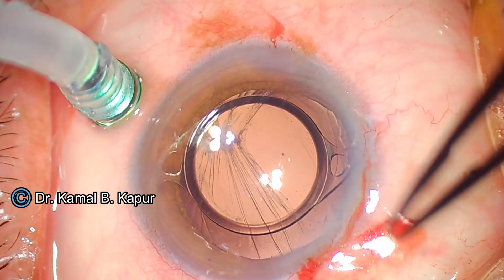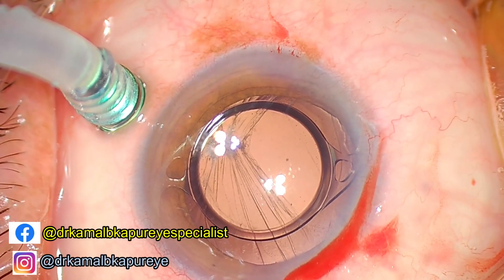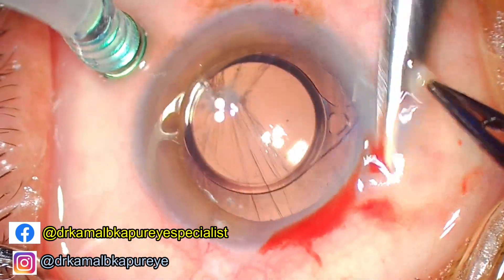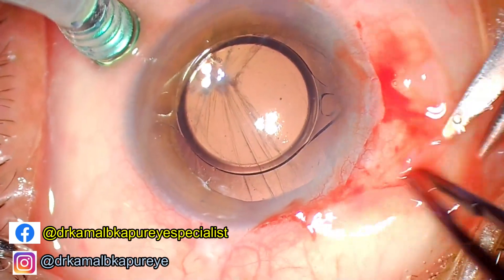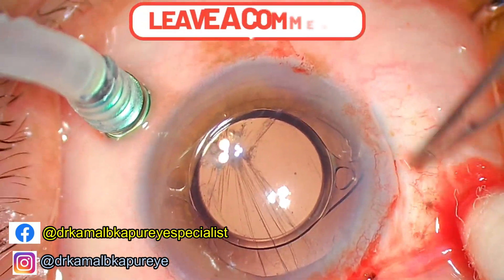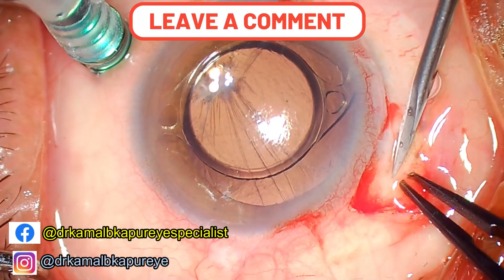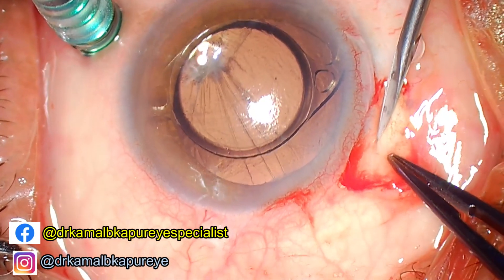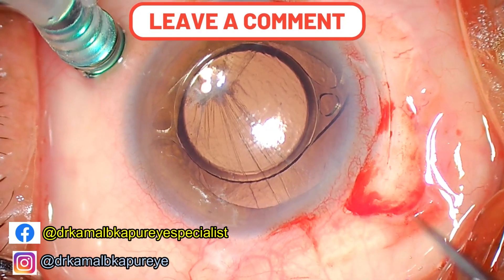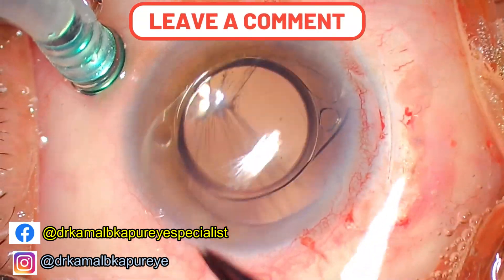Our lens is now totally out of the bag and into the anterior chamber with both haptics resting on the iris. We proceed to make a conjunctival flap and then a scleral tunnel. We use a scleral tunnel technique here because there is already an incision superiorly — I can see a big scar there — so we create a new incision in the sclera leaving a scleral band of approximately 1 to 1.5 millimeters between the limbus and the scleral wound. We use a crescent knife.